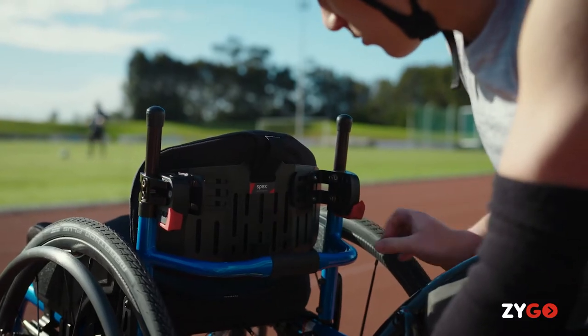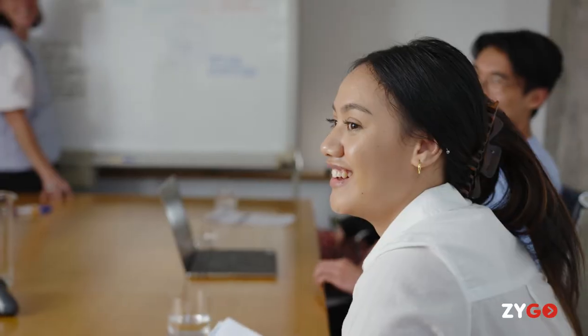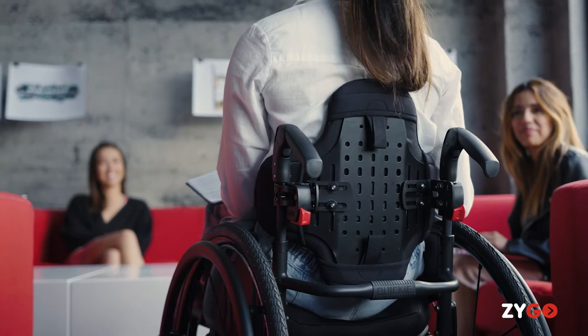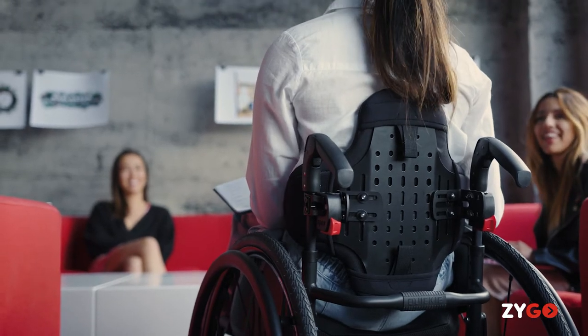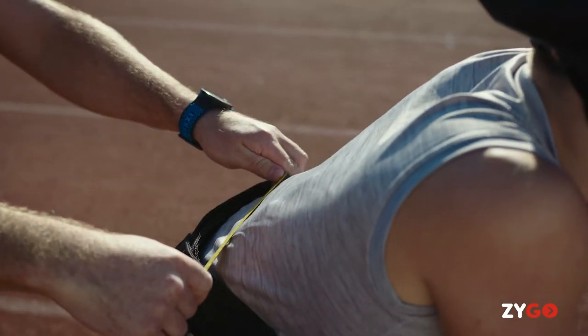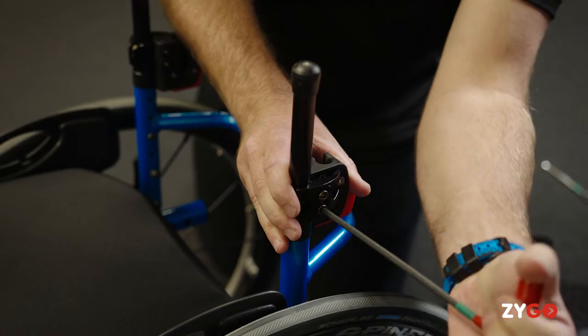The Zygo back support range includes three styles: the low style, an active contour style, and a deep contour style. With an invertible shell design, you can adjust the height of the inbuilt lateral to achieve optimum trunk stability. To enable a precisely tailored fit, a user-focused scripting process fits the Zygo according to the user's size rather than the wheelchair width.